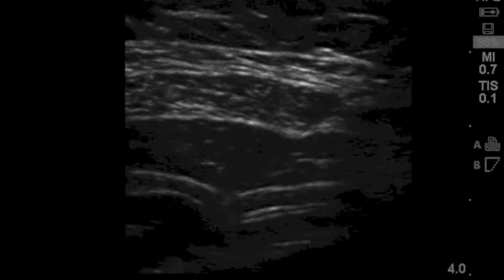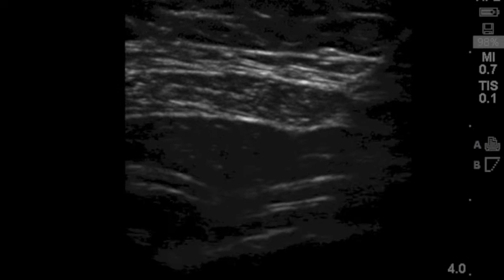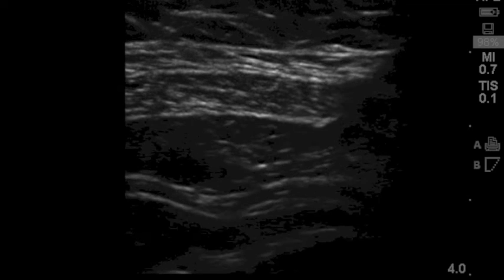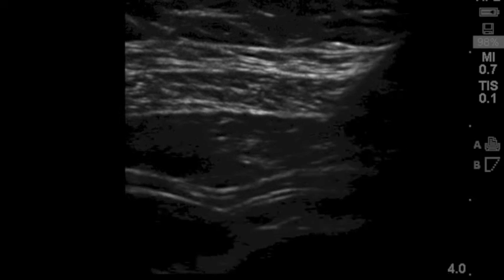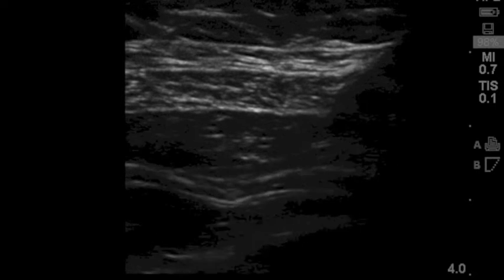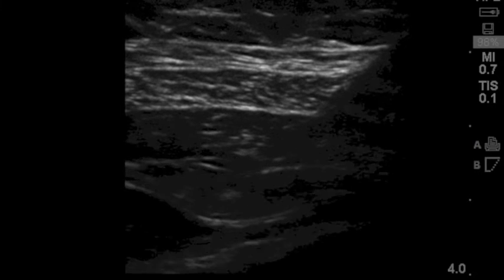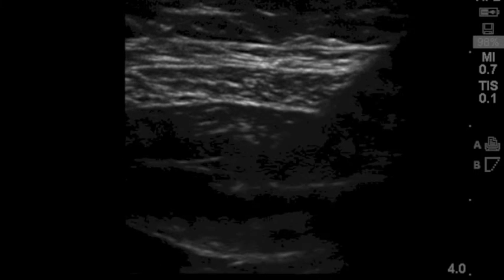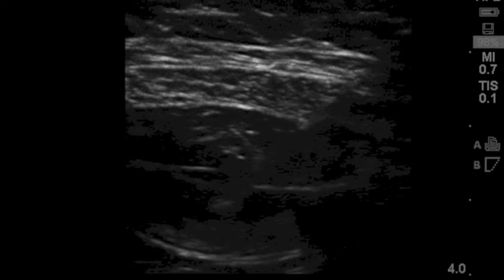This is Dr. Steven Fenkel from Stanford School of Regional Anesthesia. In this live block example for a TAP block, you can first see the needle coming toward its target. The first injection, which occurs right now, is going to sit above the proper fascial plane — you can see the local anesthetic pooling above the fascial plane. The needle is then advanced too far into the peritoneal cavity, where the second injection confirms the needle is too far. The needle is then pulled back, and the third injection, which sits in the proper plane just underneath the fascia between the internal oblique and the transverse abdominis muscle, is where you need your local anesthetic to be injected to ensure you have a proper block.